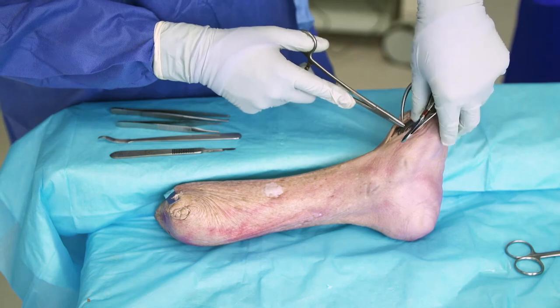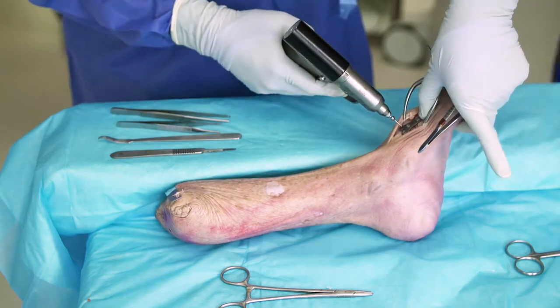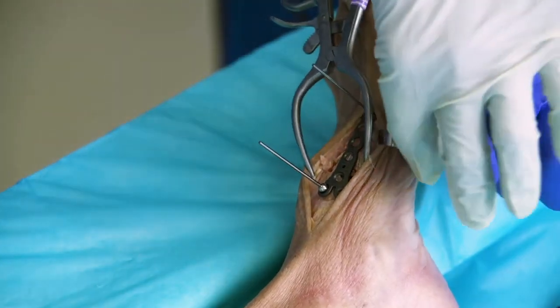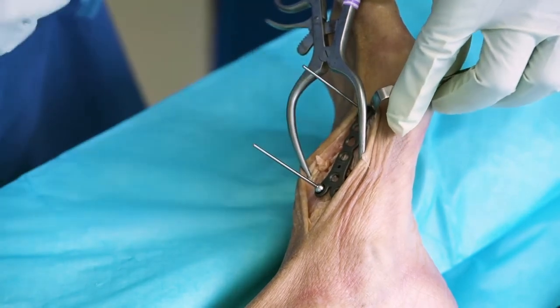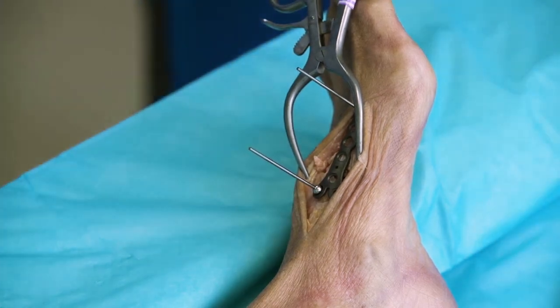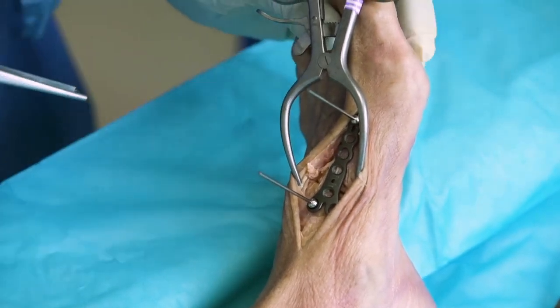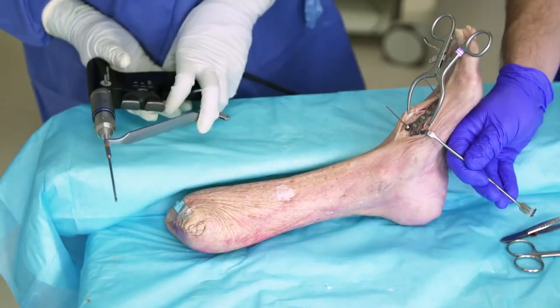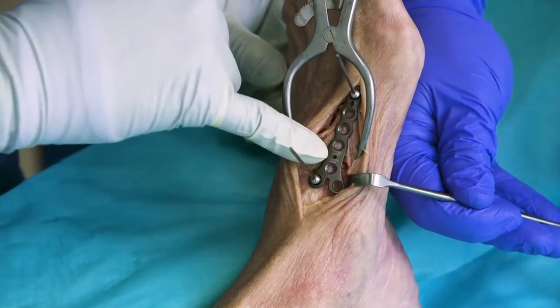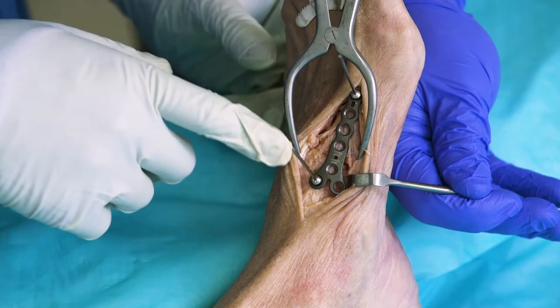These are the Y plates, which are a good configuration for this use as you can get two screws in the cuneiform transversely without risking going down to the navicular. We can use olive wires here to help position and hold the plate provisionally. The olives go in the screw holes, not in the K-wire slots, because the olive portion acts as the head of a screw and helps contour the plate at least a little bit.